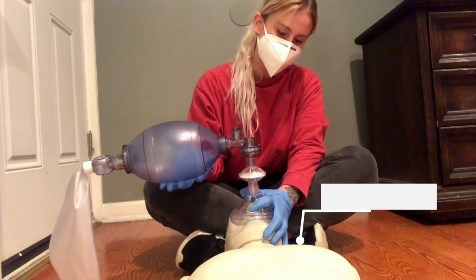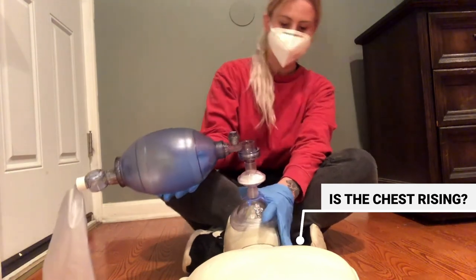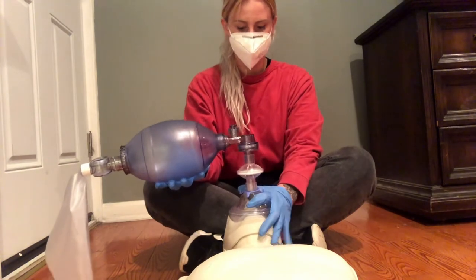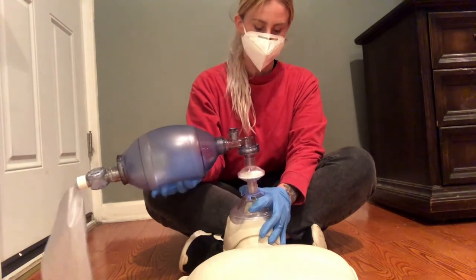Look for proper chest rise during ventilations. If you don't see the chest rise, reposition the chin. Make sure that you are squeezing the bag with enough force to make the lungs rise and fall.